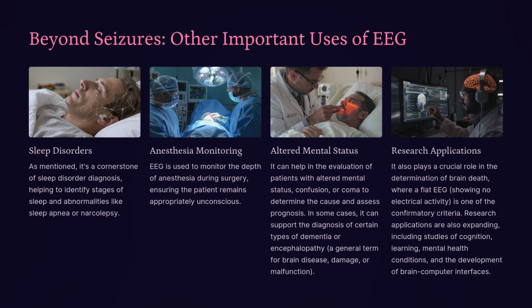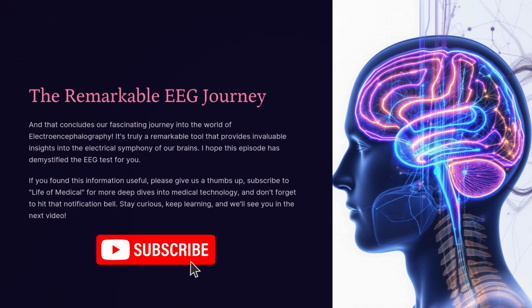It also plays a crucial role in the determination of brain death, where a flat EEG, showing no electrical activity, is one of the confirmatory criteria. Research applications are also expanding, including studies of cognition, learning, mental health conditions, and the development of brain-computer interfaces. And that concludes our fascinating journey into the world of electroencephalography. It's truly a remarkable tool that provides invaluable insights into the electrical symphony of our brains. I hope this episode has demystified the EEG test for you.